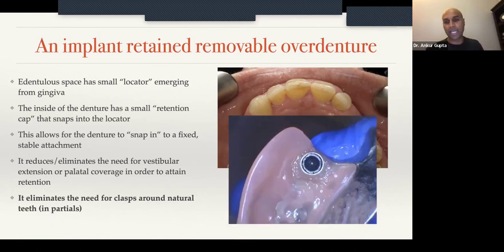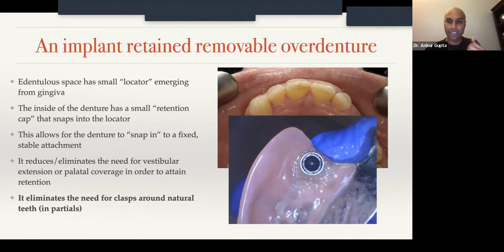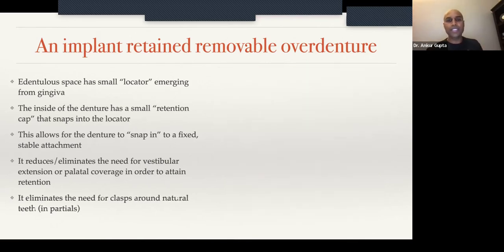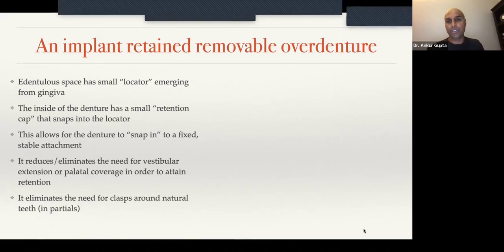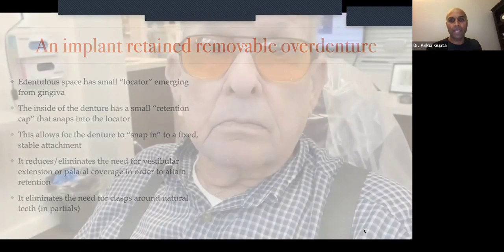Here you can see the underside of that denture. My thumb is where the tooth would normally be. The denture actually snaps into the locator rather than clasping onto the teeth. It's just a better service to offer to patients. I used to hate making dentures. I now love it because it's incredibly gratifying.